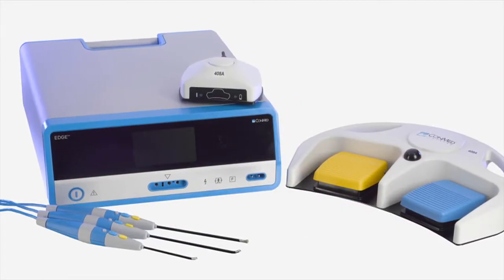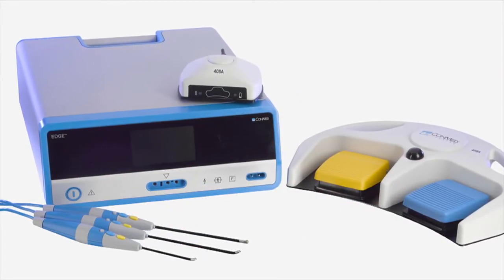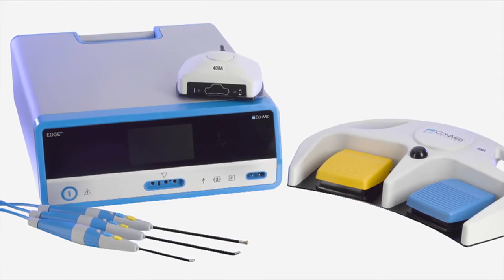The system consists of a generator, versatile bipolar probes, and an optional wired or wireless foot controller.